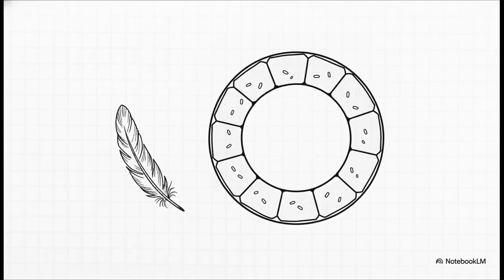Okay, let's transition over to our second suspect, the distal convoluted tubule, or DCT. Because it sits much further down the nephron line, it handles a significantly lighter reabsorptive workload. And because of this, the cells are just smaller, uniform cuboidal cells. More importantly, though, they totally lack that prominent brush border. Without those long microvilli crowding up the space, the inner lumen of the DCT appears wider, much more clearly defined, and strikingly empty compared to the PCT.